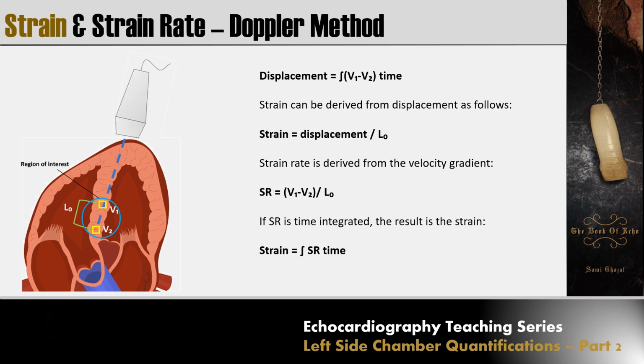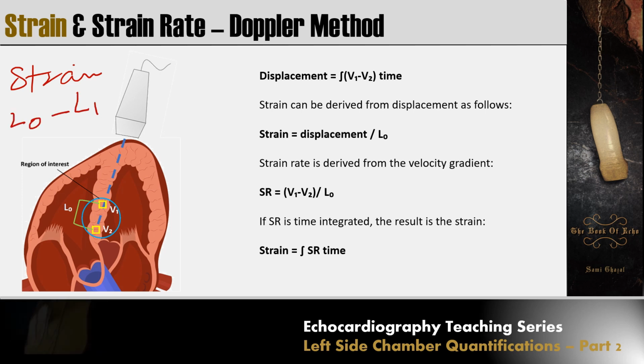Strain rate is easily calculated. It is the rate of deformation. By definition, it is strain divided by the time it took from L0 to reach L1.